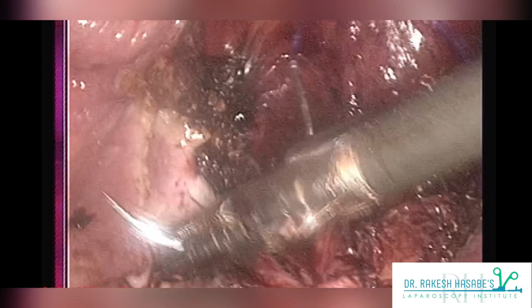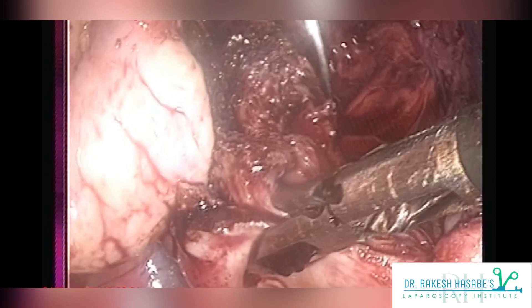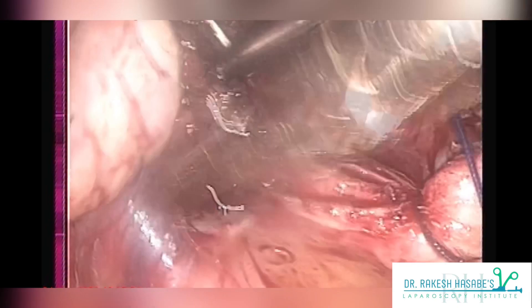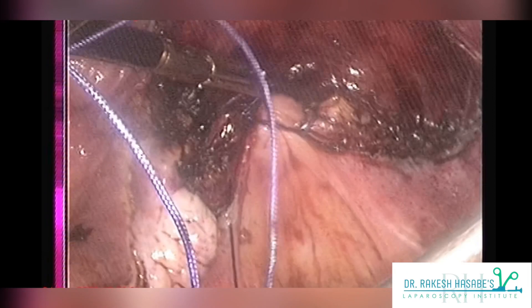This is entirely an unedited video of laparoscopic vault suturing, purely made for teaching purposes to demonstrate the easiest way of performing the procedure. Moving on to the last and final stitch — many times the opposite-sided edge of the vault gets tucked downwards because of the approximation by interlocking or continuous suturing. Simply lift the angle of the opposite-sided vault with your grasper and take a bite. Most importantly, do not forget to take a bite through the uterosacral ligament.